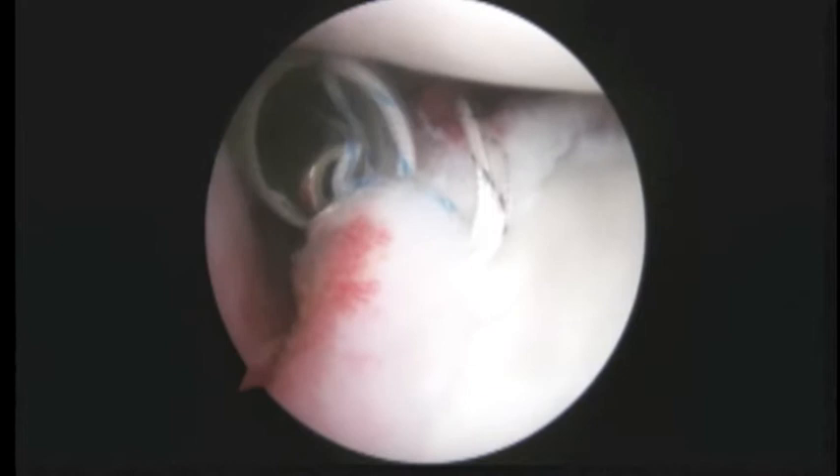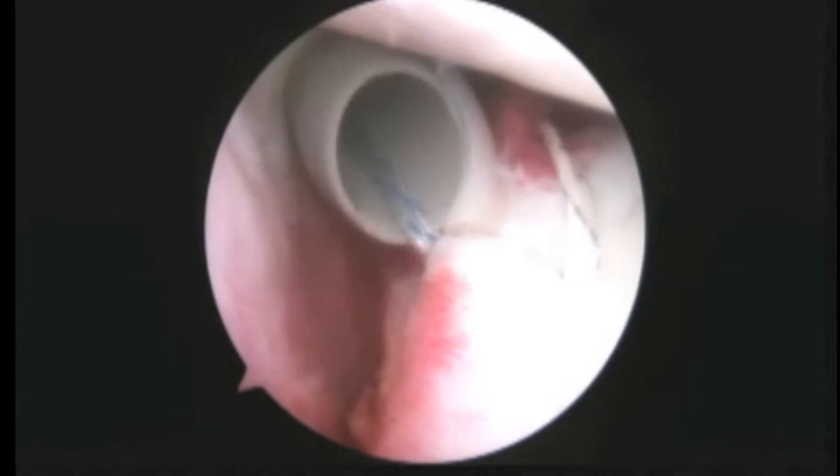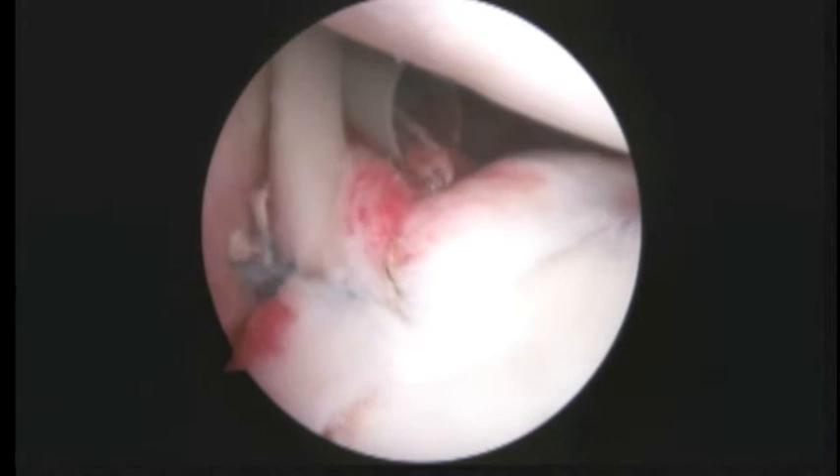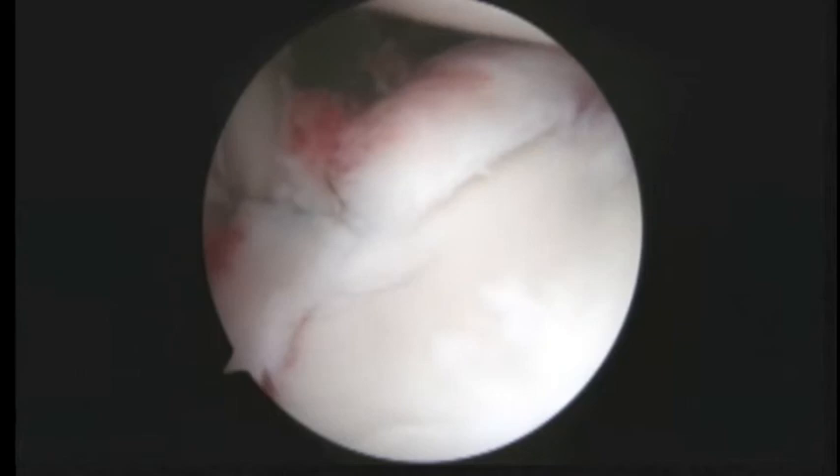I'm going to show you just locking it down. We'll finish this and show you some more. We're just finishing tying the second suture and that looks good. We're going to go ahead and clip that suture tail and then we're going to be done with the SLAP repair.